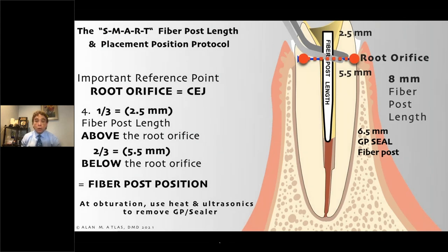Because the person who did the canal or did the obturation knows the canal anatomy very well. But I usually recommend a heat instrument. It will remove it pretty quickly and effectively. That's the beauty of this. I've given you the exact position of that post, so you never have to touch it again. And you'll see the importance of that.